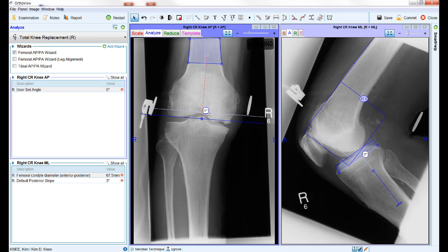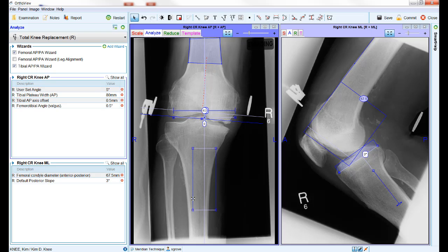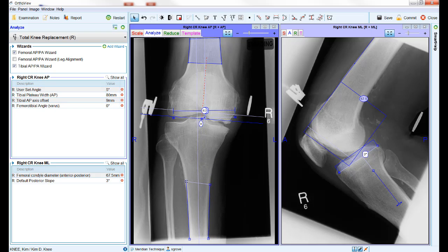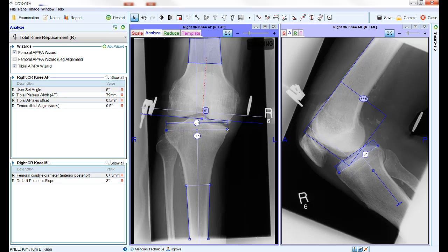For the tibial AP/PA wizard, position the rectangular box so that the four corners are on the edges of the tibia, again picking out the longest straight section of bone to create the anatomical axis of the tibia. The blue bar can be dragged down and resized using the control points on each end so that it sits across the tibial plateau. The leg alignment wizard is not used in this procedure as it requires the femoral head to be visible on the x-ray.